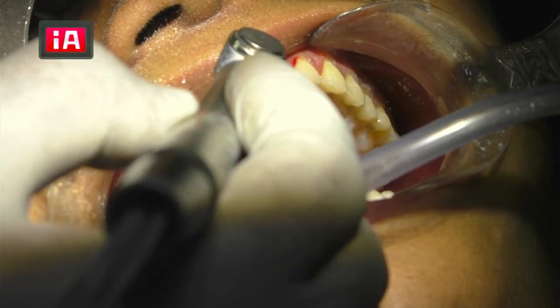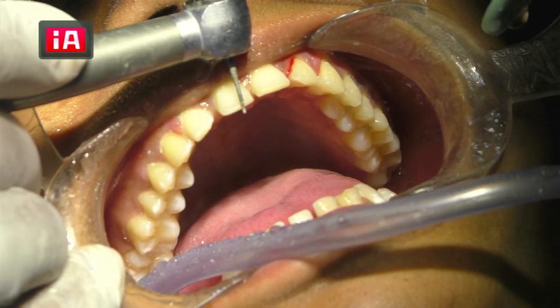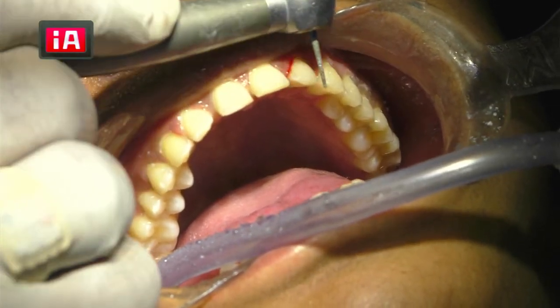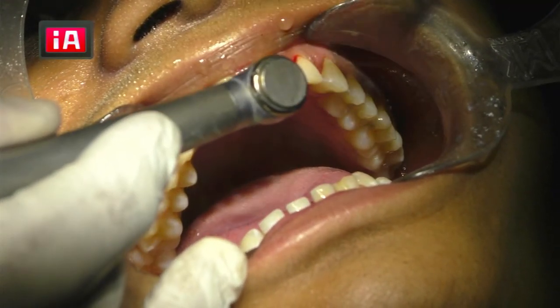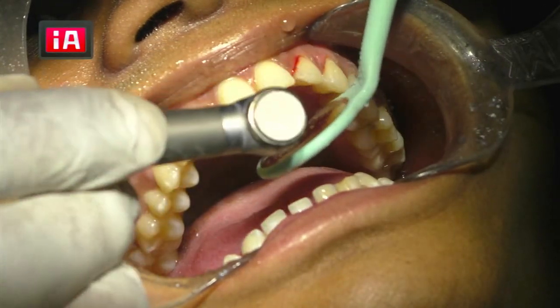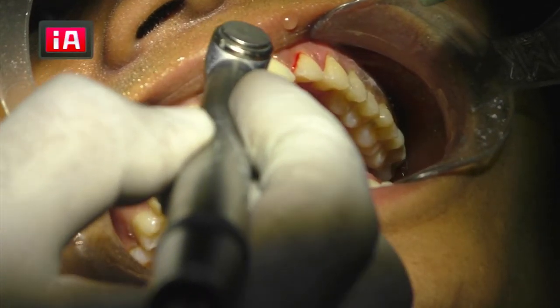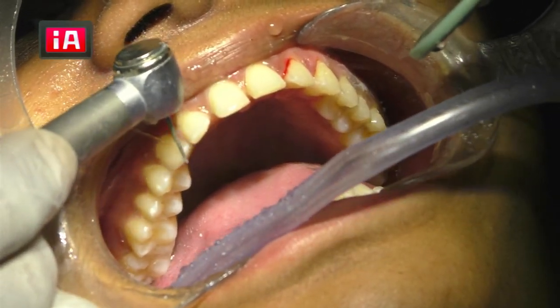I'm not going to reduce so much of the inside surface, only slightly. Some people make a groove here and reduce it like that. I don't make the grooves as such, because the tooth is already small, I'm not going to make it bigger. It is not required, I just have to cross the incisal edge. I'm going to reduce slightly the incisal edge of all the teeth, so that there is enough area for the veneer preparation, manufacturing.